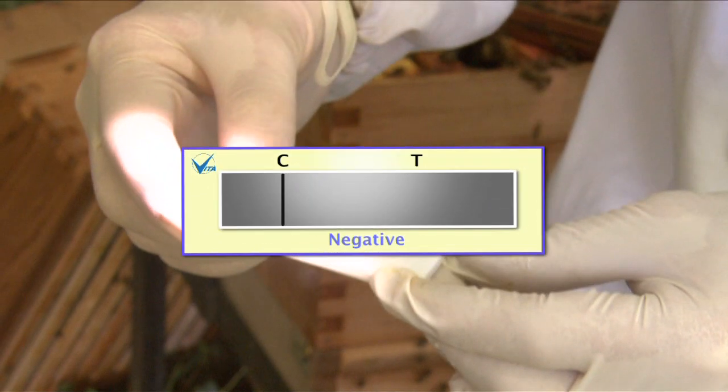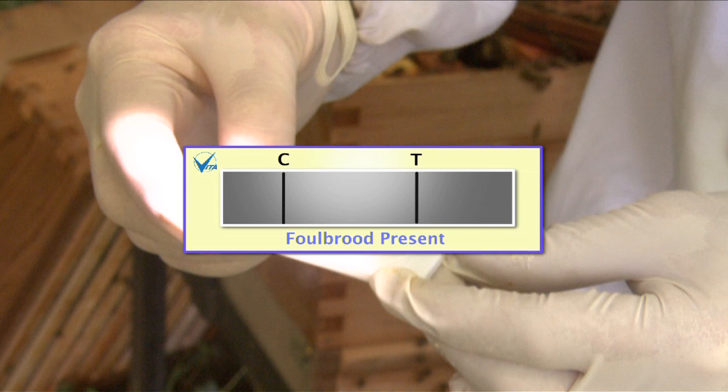After about three minutes, if only the control line shows, then the result is negative. If the test line also shows, then Foulbrood is present. You can tell if a colony has the disease within three minutes by using these kits.